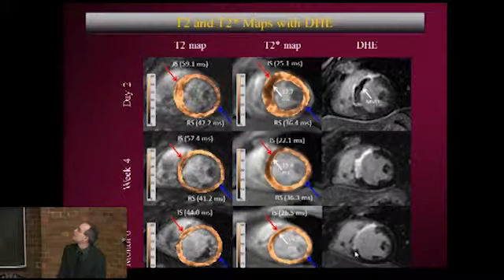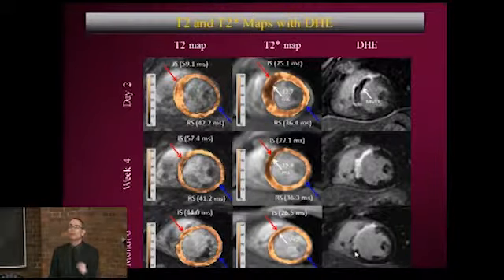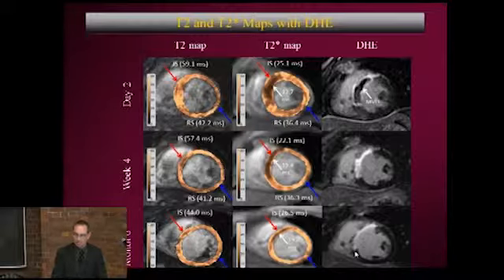If we look at the hemorrhage map, again, you see this dark zone suggesting significant hemorrhage in that region of microvascular obstruction, which slowly does resolve, although there's still some evidence of it even out to the 6-month time point. And again, in the delayed enhancement images, you can see the microvascular obstruction, which certainly clears up by the 3 to 4 week time point, but this is all eventually resolving in a transmural infarct and a thinned wall. So this is a completely fibrotic wall, completely non-functional, obviously very problematic. And you may also get a sense that the heart may be slightly enlarging.